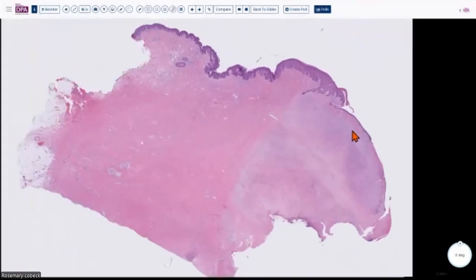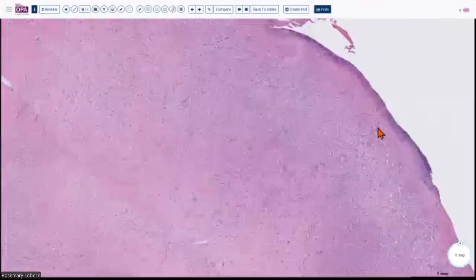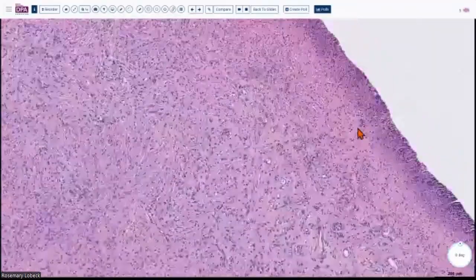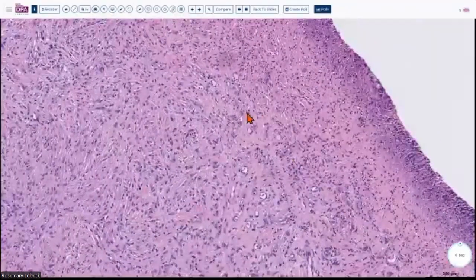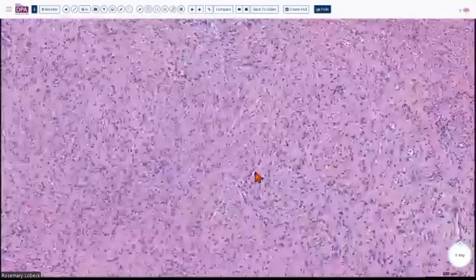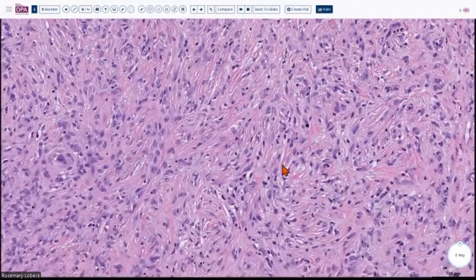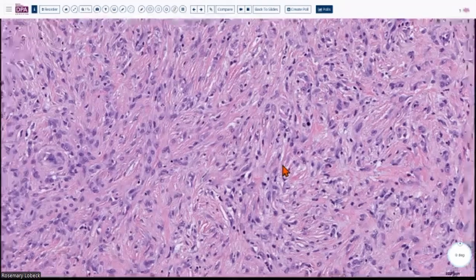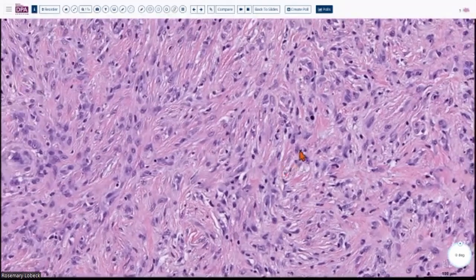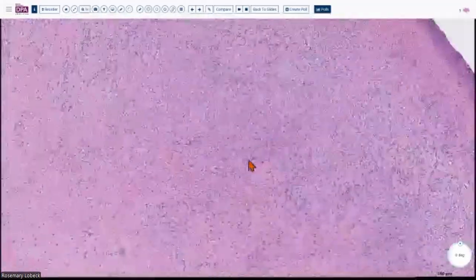On this side, let's take a closer look. So you're seeing this ulcer bed with some neutrophils and some granulation tissue, and then you see a myofibroblastic type cellularity going on just underneath that granulation tissue. So it kind of looks okay for granulation tissue. It can be exuberant sometimes, but as you look closer, you're like, maybe the nuclei are a little bit plump, maybe there are some nucleoli, maybe this is something else going on.